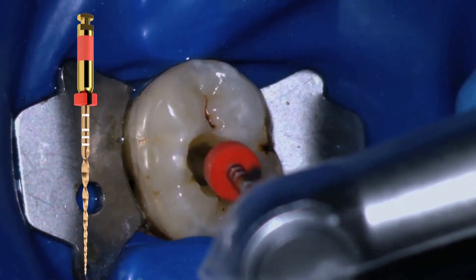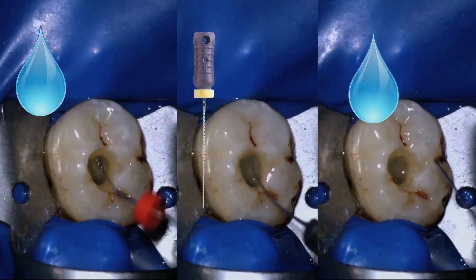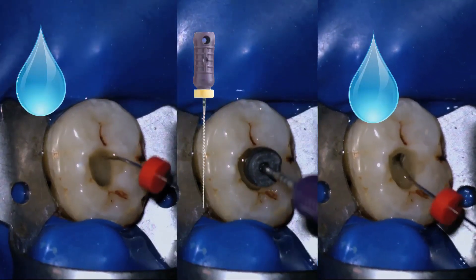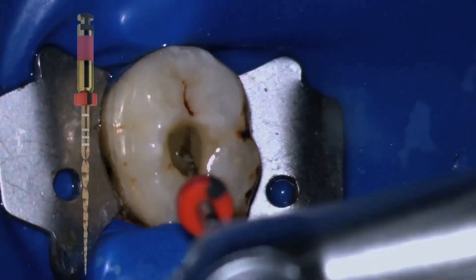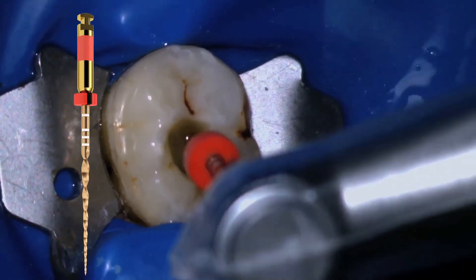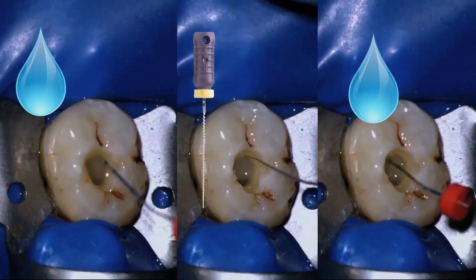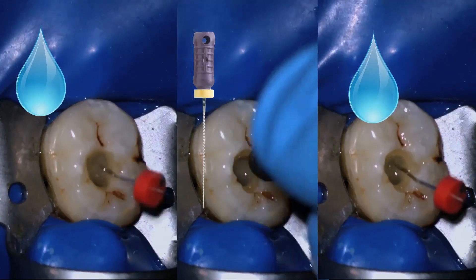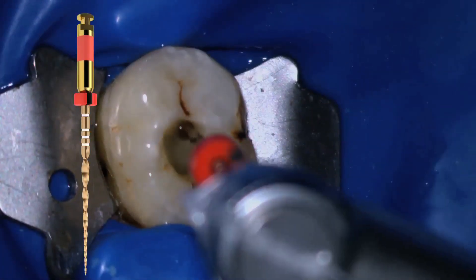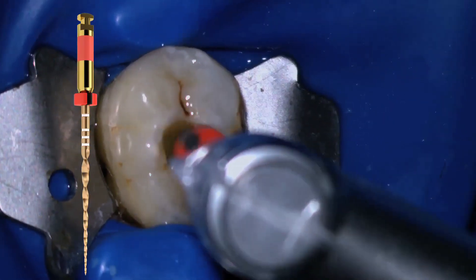Then we use WaveOne Gold in amplitude strokes of three millimeters inside the canal. We can see on the left that we are irrigating and in the center we are confirming the canal is still patent. After a file comes out of the canal, more irrigation is required. We continue with WaveOne Gold for the second time — another three to four millimeters amplitude strokes — preparing the middle of the canal. We irrigate, make sure we have not blocked ourselves, irrigate again, and continue until we reach working length with WaveOne Gold.